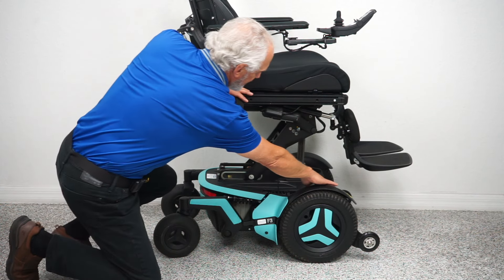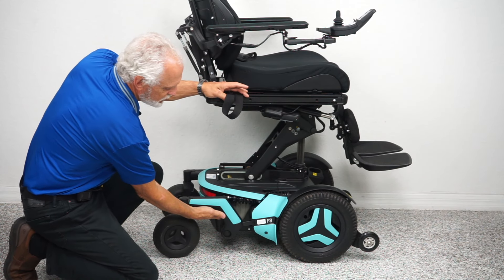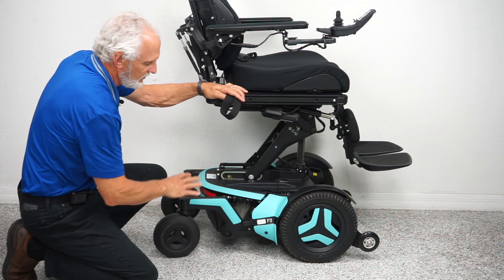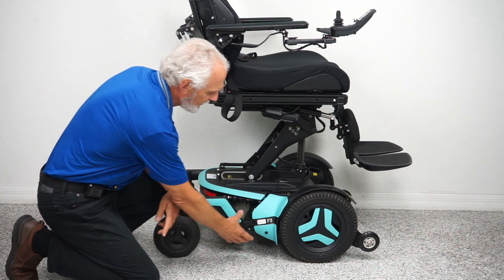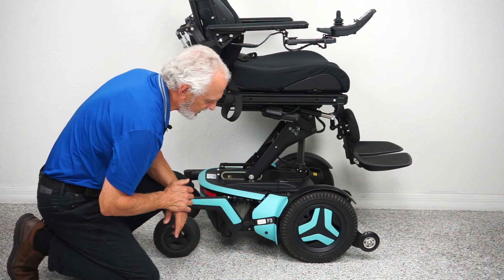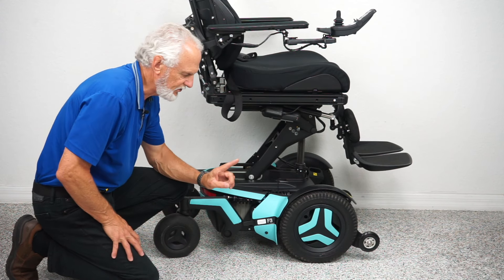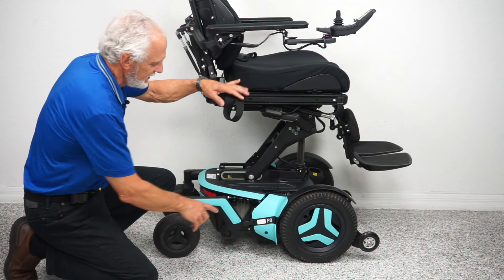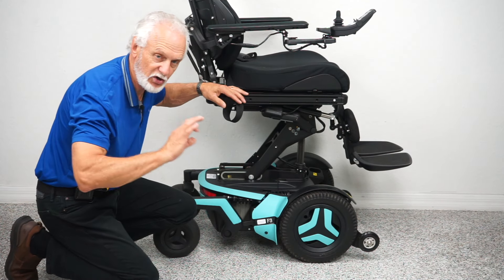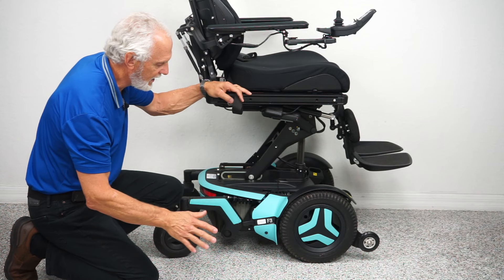This chair also has anchor points here and here for securing the chair during transport — you have four of those around the chair. You also have a motor for each wheel. You can't see the motor because it's behind the plastic fender, but you can see the neutral lever right here. This motor is connected directly to the hub — there's no chain, no belt — so it's very dependable and very quiet.